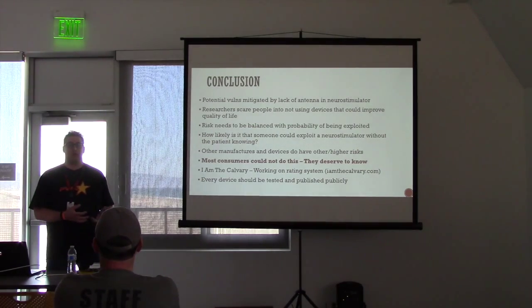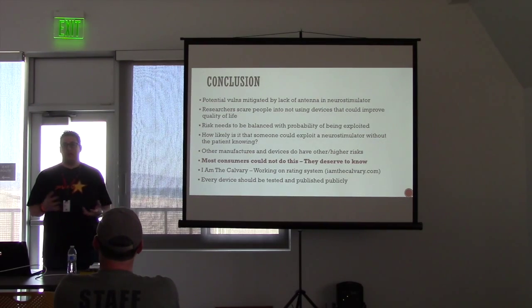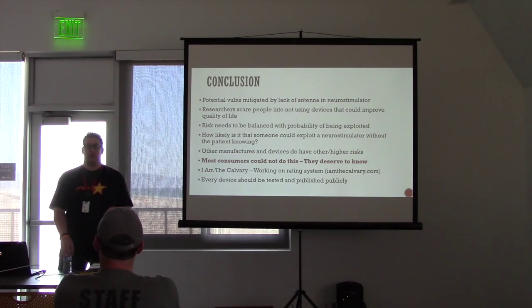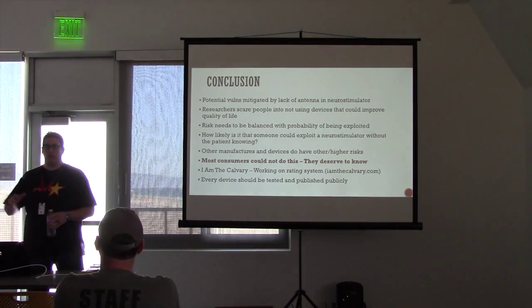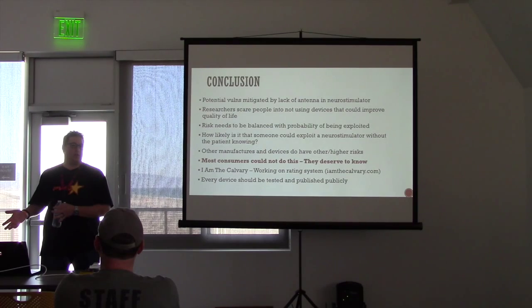And if some of those researchers got a lot of heat from parents who said, all right, you've scared me, I'm taking this device out of my child, but I don't really have a good way to do this. The problem is, it's a vulnerability, and we all agree, but the likelihood that someone's going around trying to pick off kids with these kinds of devices is highly unlikely. Now, when Cheney in 2007 had his defibrillator, they disabled the wireless because he was the vice president of the United States at the time, and there was a high probability that someone would have tried to attack it. But it's a very different scenario.